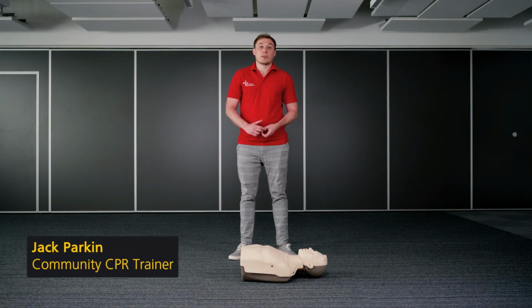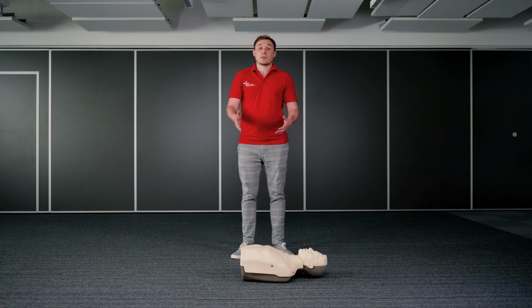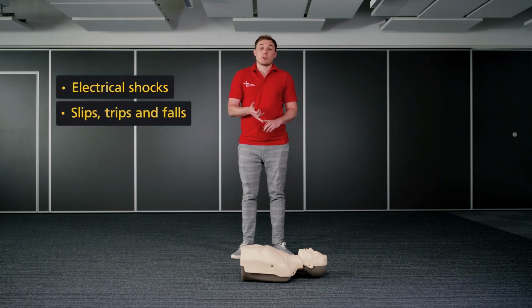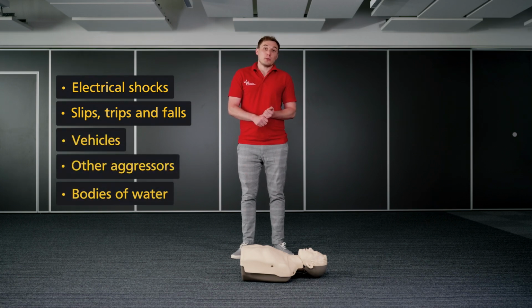Today I'm going to be demonstrating effective compressions and the safe use of an AED to support someone that's in cardiac arrest. Before I engage with the casualty, I'm going to be looking out for any dangers in order to keep myself safe in this situation. The sort of dangers I may come across could be things like electrical shocks, slips, trips and falls, vehicles, other aggressors or bodies of water.